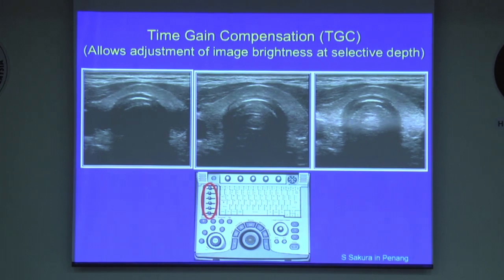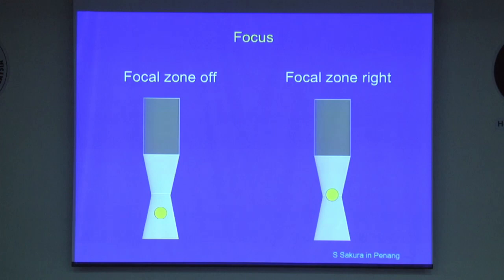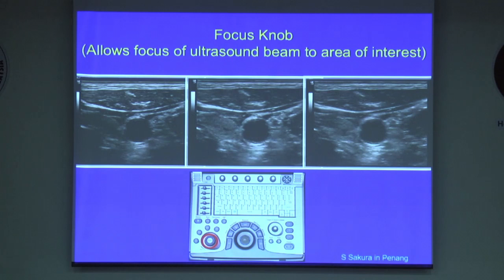Ultrasound beams can be focused, like a light can be focused through a lens on a camera, and the focal zone is where the greatest beam intensity occurs and the image resolution is the greatest. So it is very important to adjust the focus at the level of the target, because that is where the needle tip is approaching.